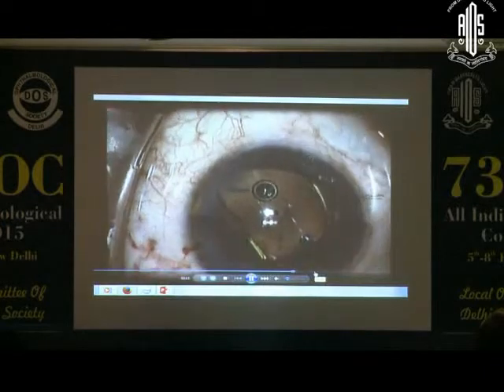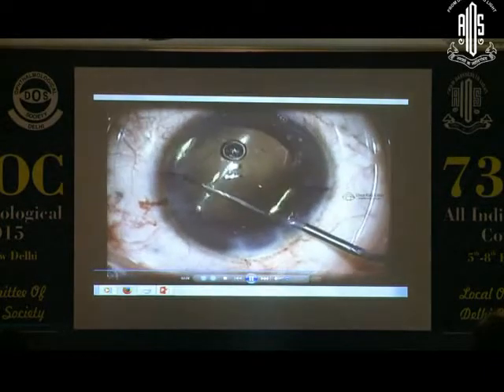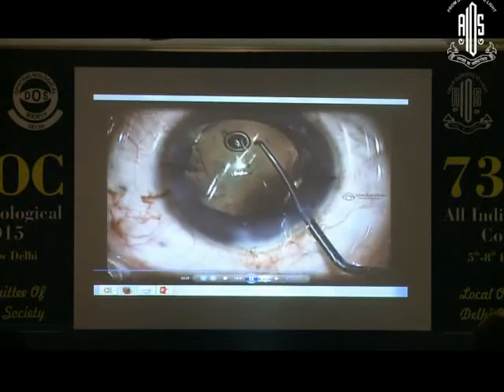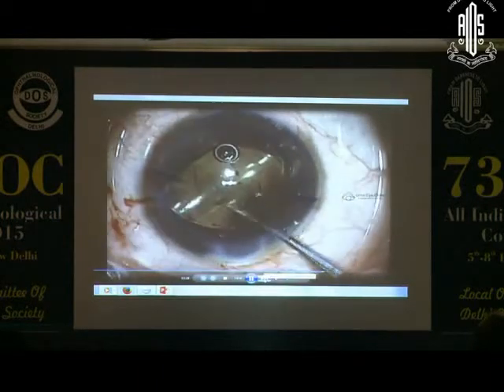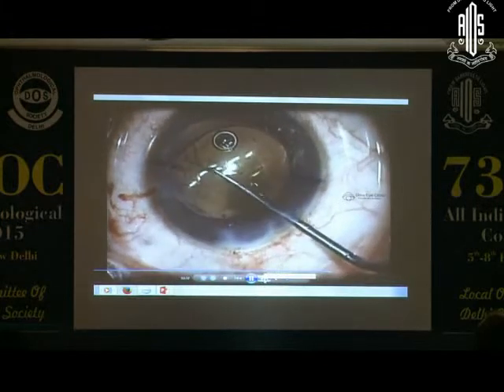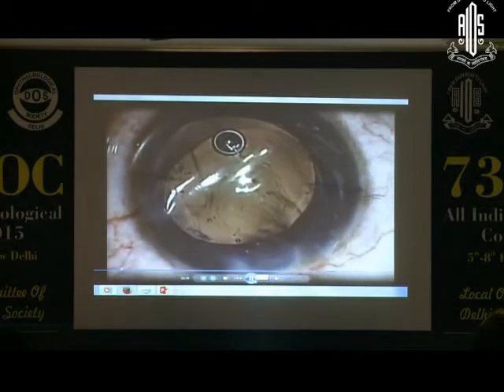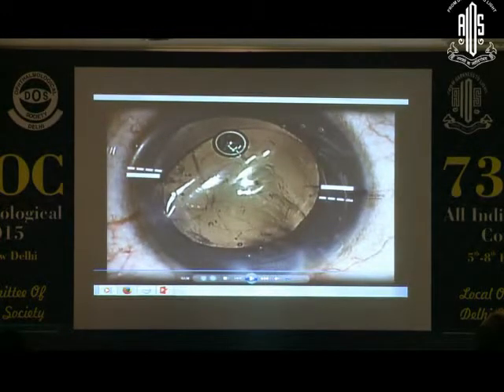Again rotate and stop about 10 degrees short, as you can see here. Just 10 degrees short, and take the viscoelastic out. At this point, this is the marking, and that is the lens mark, that is the intended positioning of the lens.